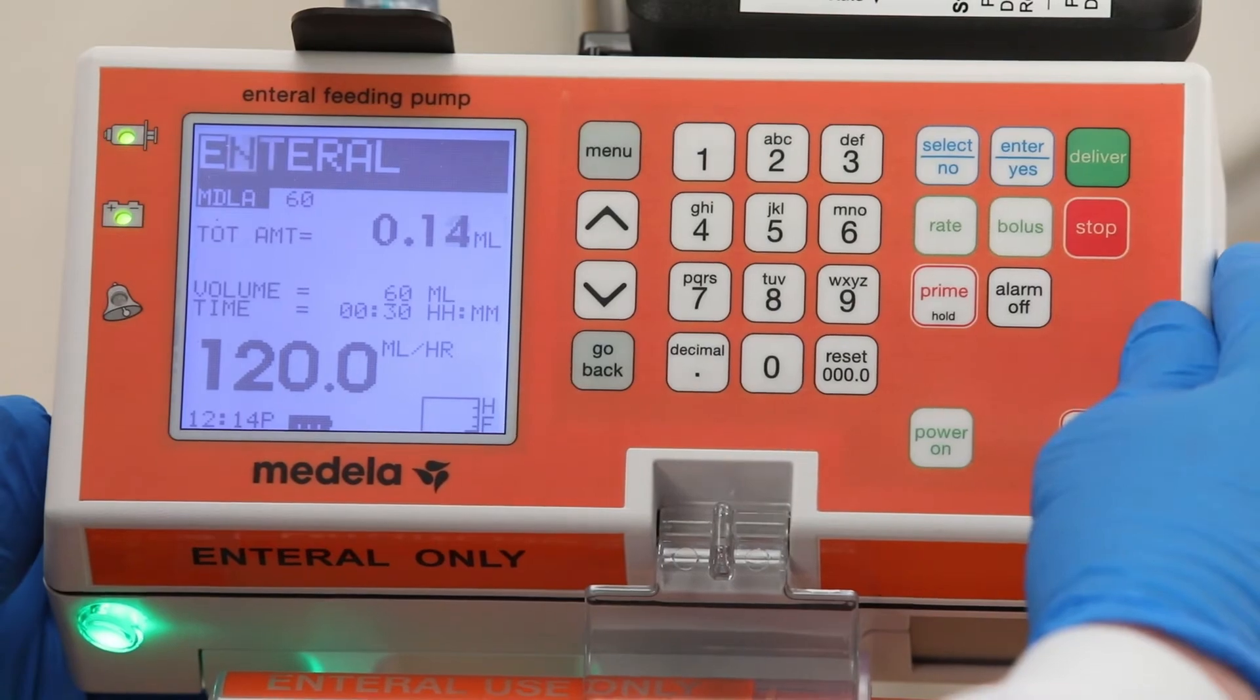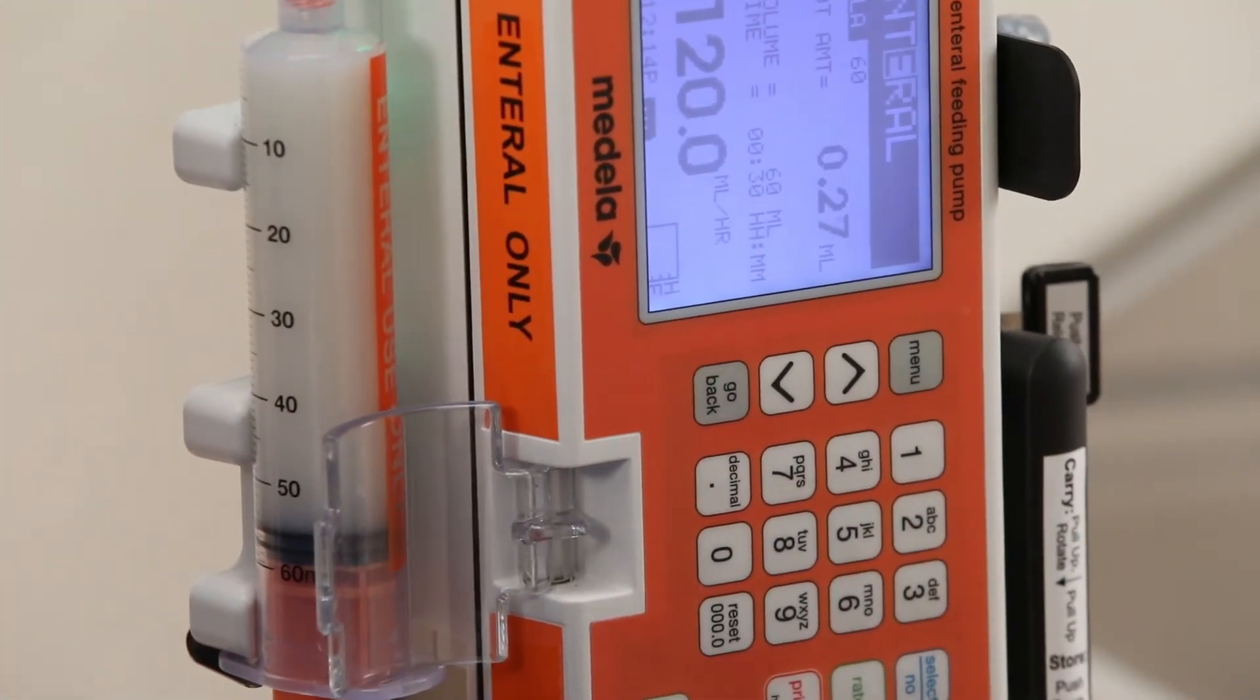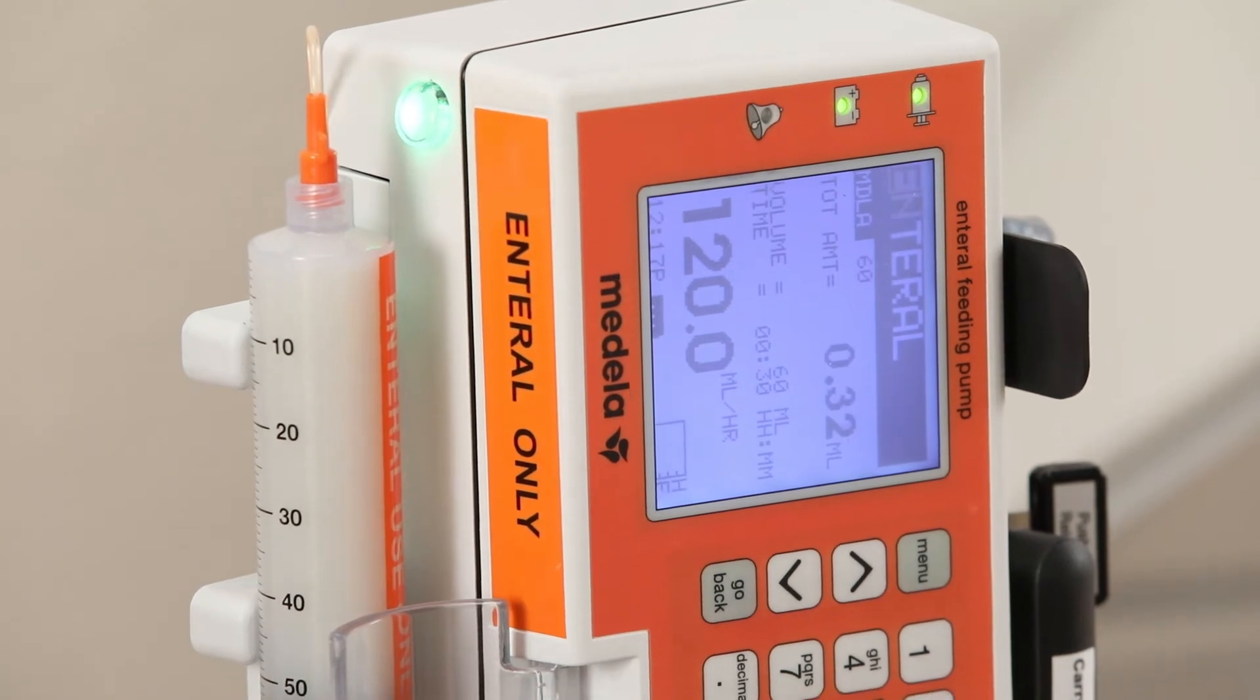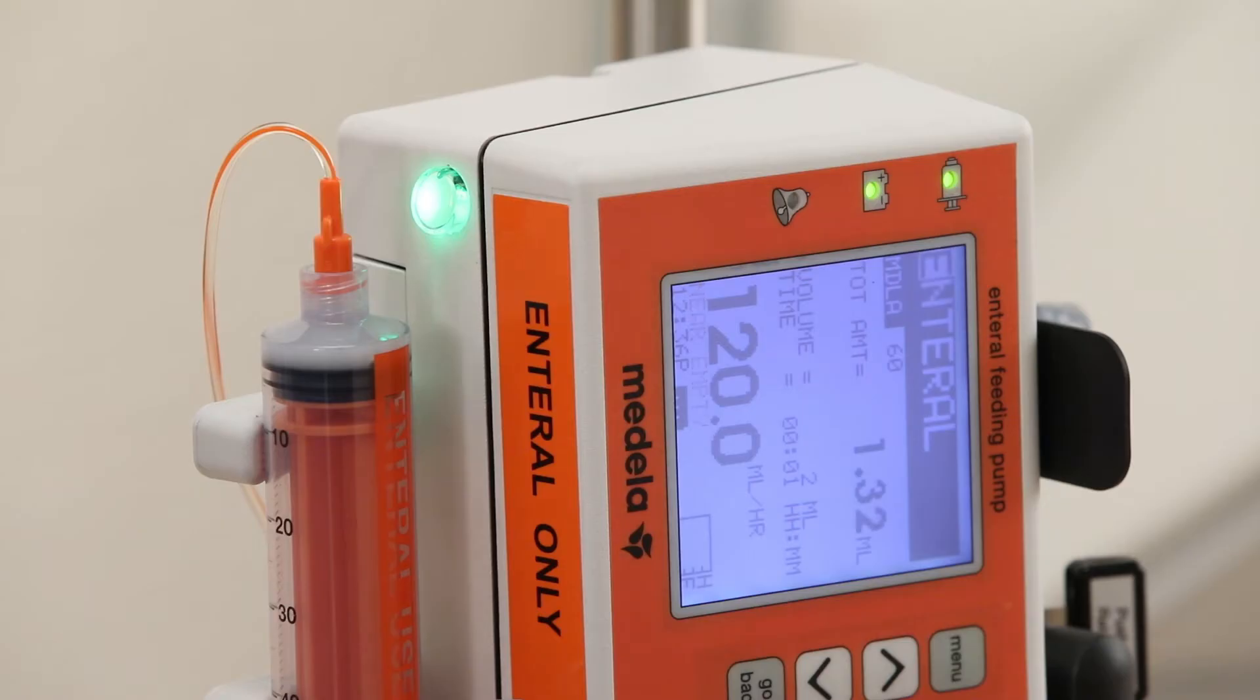Once the feeding has started, rotate the pump upright by applying a gentle force in the desired direction. Rotate the pump vertically so that the syringe tip is upright to maximize fat delivery. Once feeding is 5 minutes from completion, an alternating red-green indicator light will flash.